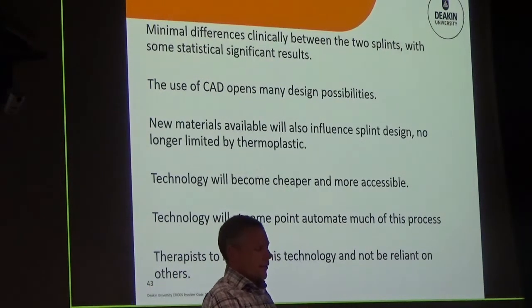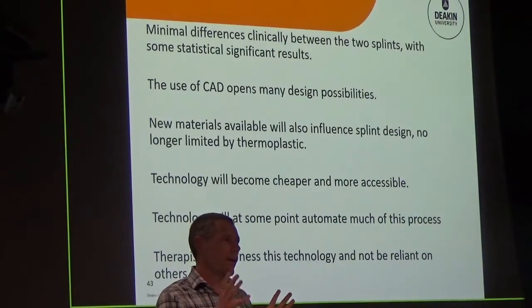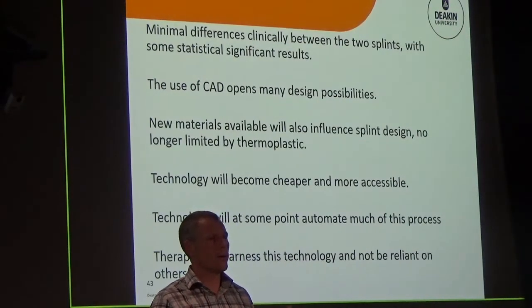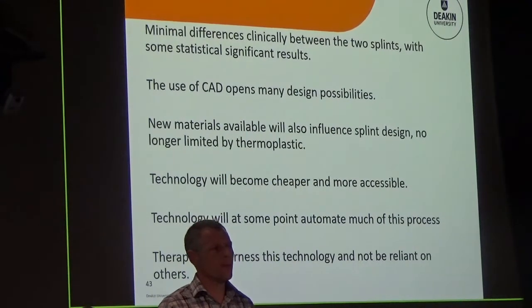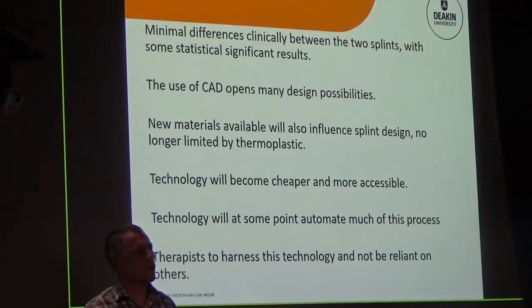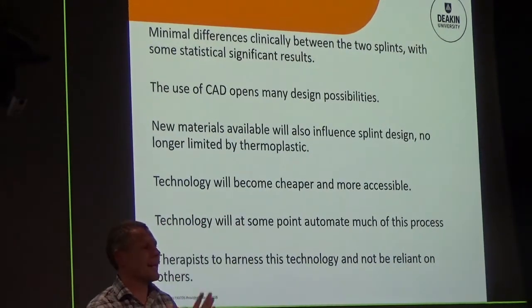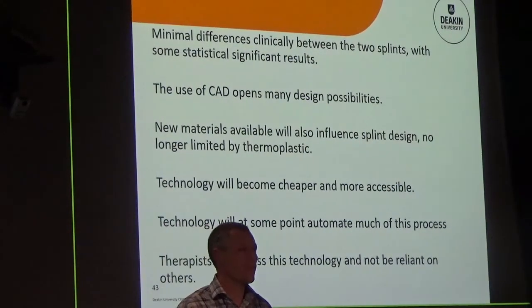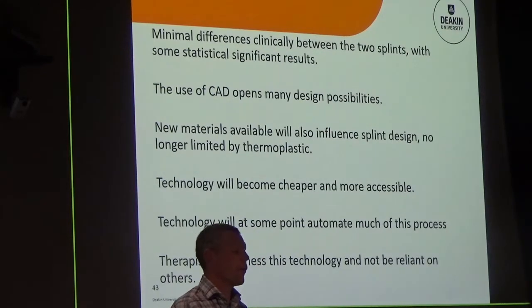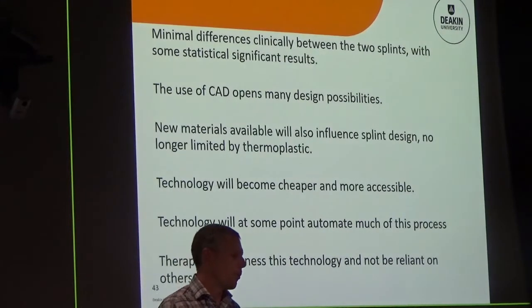Which is another discussion. So the use of computer-aided designs opens up so many options. So everything that we do, we can actually modify on a screen and change it before we go and spend time and effort. The best thing about it is once you've made that design change, it's there forever. So that you have that same client come back and you go, yeah, I remember doing something like that. There it is, pops up again, exactly. Not sort of, I made it sort of good last time, sort of bad last time. It's exactly the same every single time. So then you can modify it for another client, you can keep it in a record for what you made them, the opportunities. The amount of materials being used is also significant.